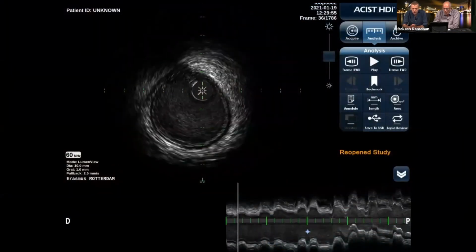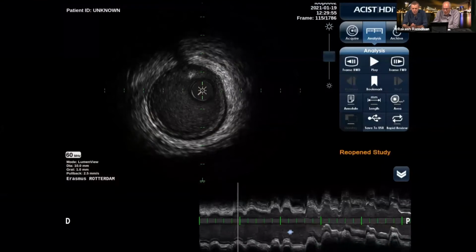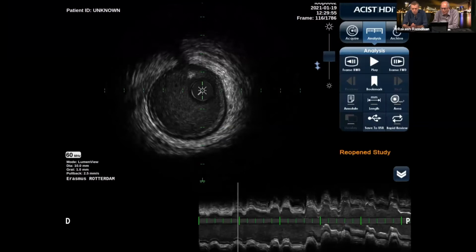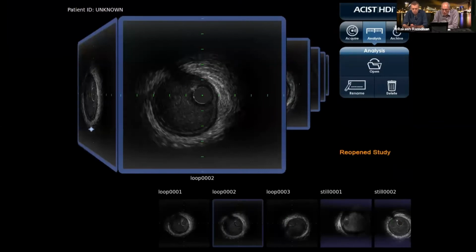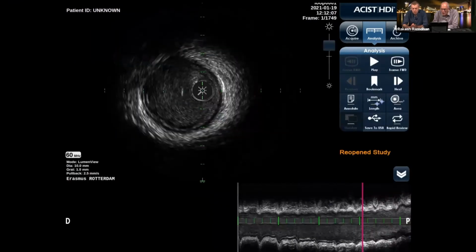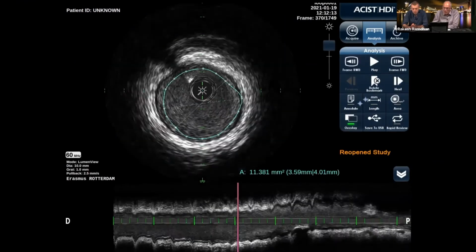So maybe we can use the distal measurement you already made, Jurgen. Oh, sorry, I have to go back to the former one. It's there, but I was already a bit ahead on that. So we have here our measurement. So that is 4.0. Yeah, the diameter.